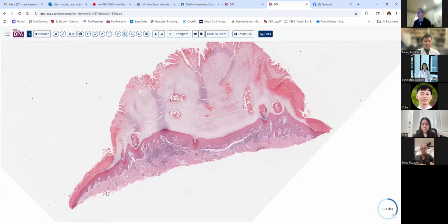I think very, very often you have different levels of skill in terms of the excision as well. So you've seen the varying depth of excision. This one is still mostly in the papillary dermis, so there probably wouldn't be too much scarring. And some dermatologists are extremely adept at doing these superficial shave biopsies.